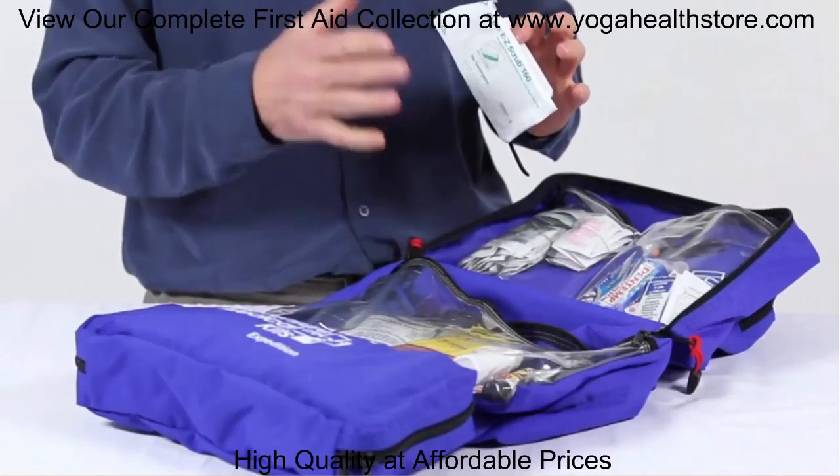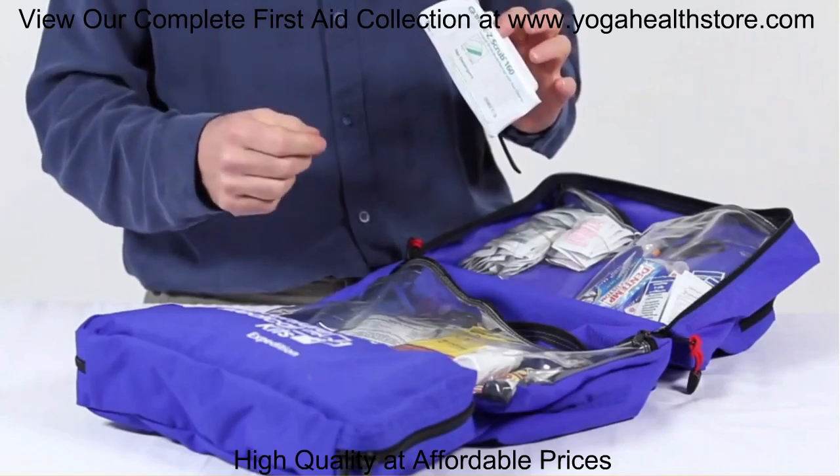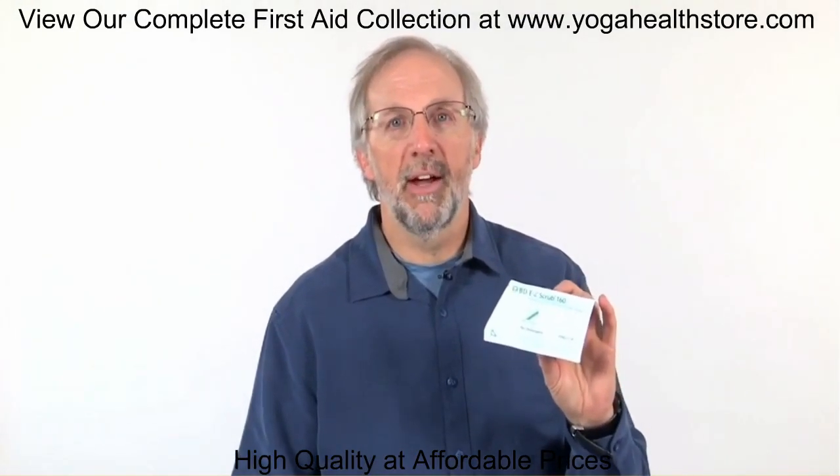This kit goes beyond most first aid kits. Inside we have an irrigation syringe for cleaning wounds and a sterile scrub brush for cleaning gravel and dirt out of wounds.